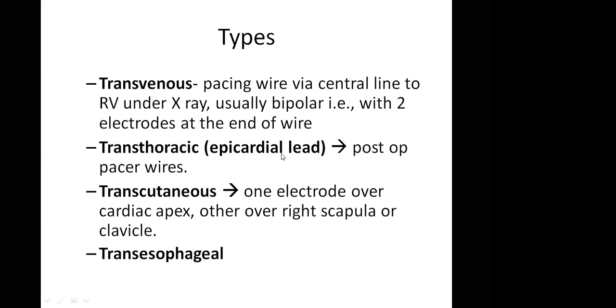So it should look like a needle that will pass through the skin, touching the epicardium. It is also used for pacing and is easy to remove, just remove it through the skin. You don't have to do transvenous, to avoid infection. When they just put a patch or a valve, you don't want infective endocarditis from putting a transvenous lead into the atrium. So these are some indications where you do an epicardial lead. We've talked about transcutaneous. I've not seen transesophageal before, but it exists. But I've seen the other three.